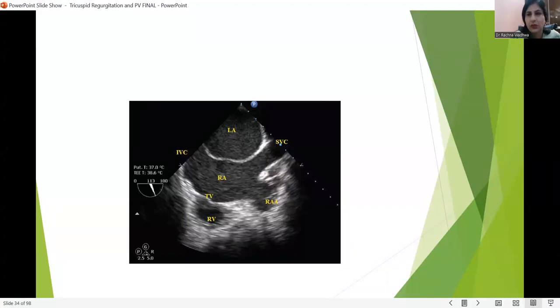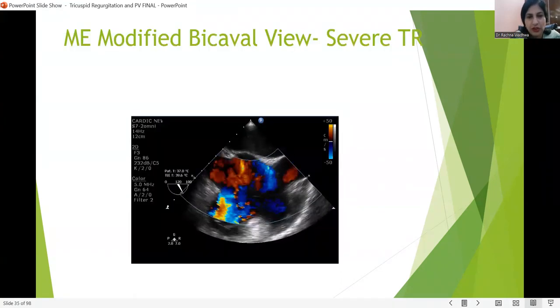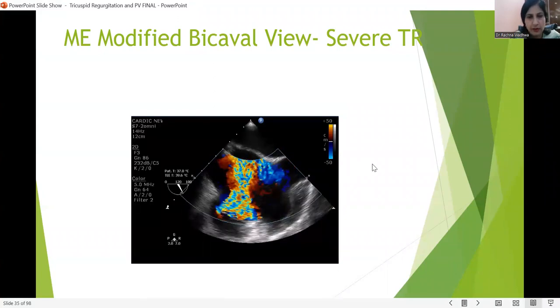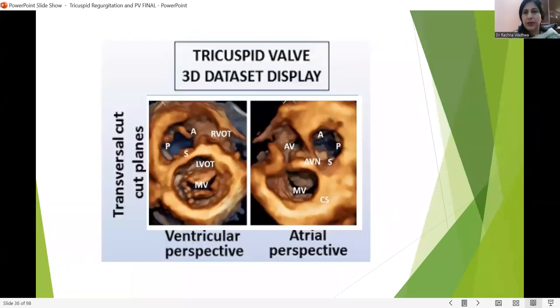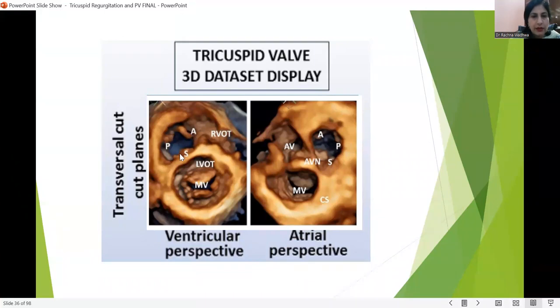This is massive tricuspid regurgitation in the mid-esophageal bicaval view, showing severe TR. With 3D assessment, this can be done from both the atrial perspective and the ventricular perspective. From the ventricular side, just above the RVOT, we can see the anterior, posterior, and septal leaflets. From above, from the atrial side, we can also clearly see anterior, posterior, and septal — properly aligned, seen from above.